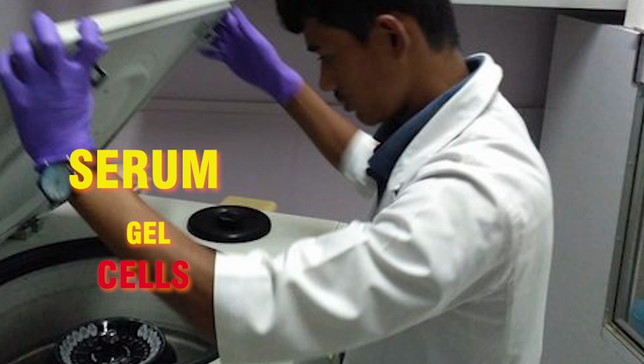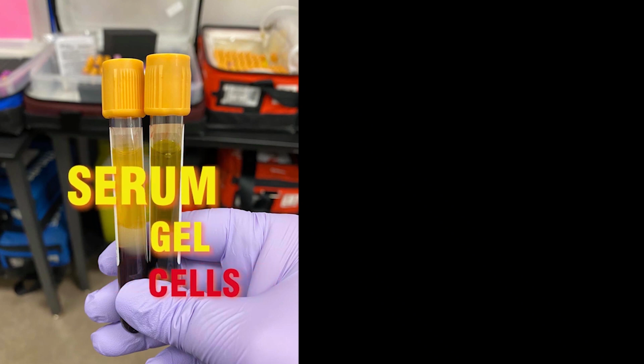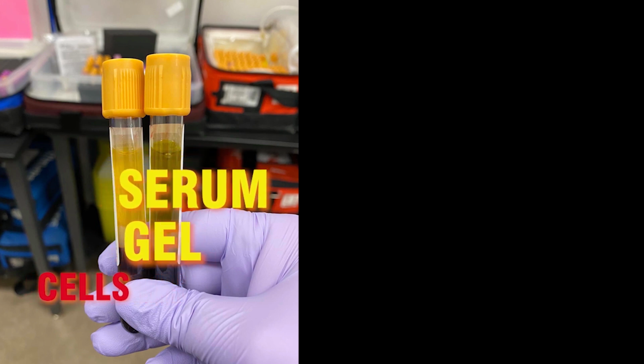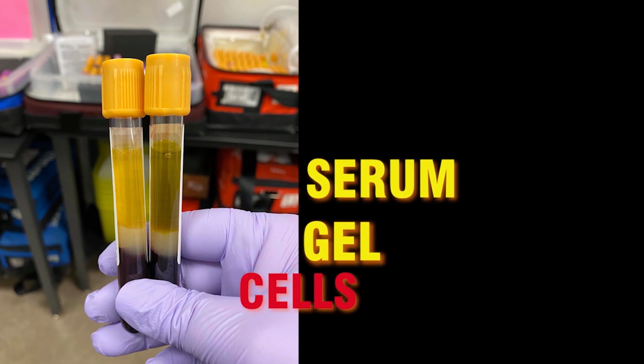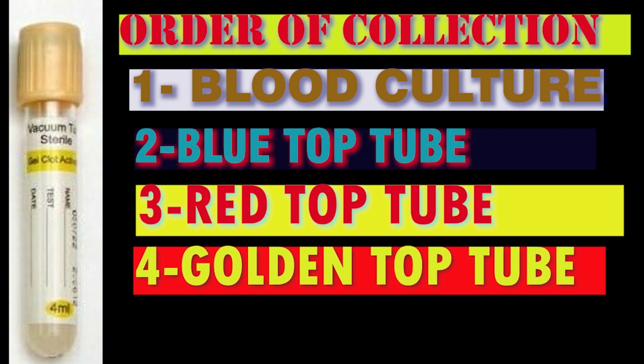Keeping cells and the serum or plasma together in the test tube for a long time can decrease the analyte level. For example, glycolysis is the usage of glucose in the serum or plasma by the cells in the test tube, which decreases the glucose level. So the gel present between the serum or plasma and the cells minimizes the usage of the analyte by the cells.